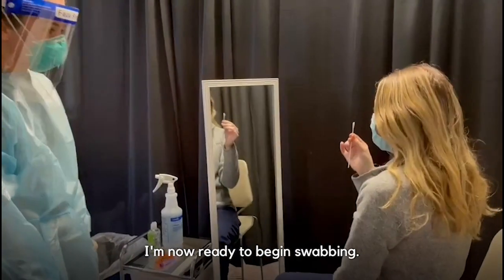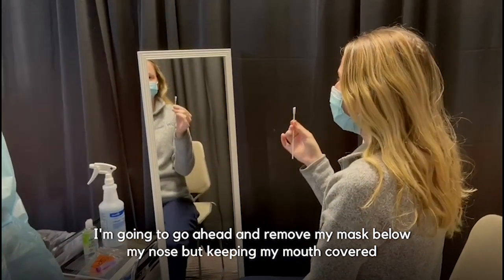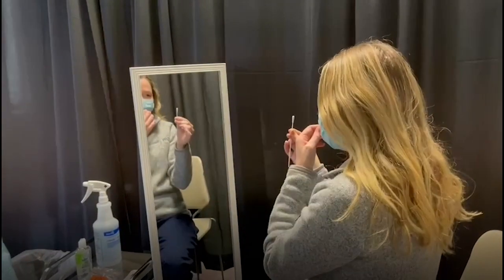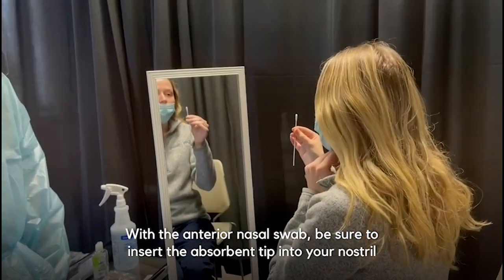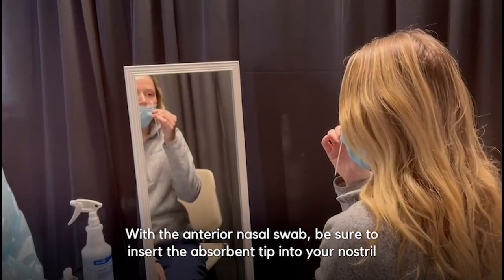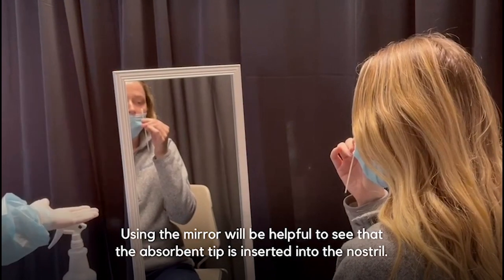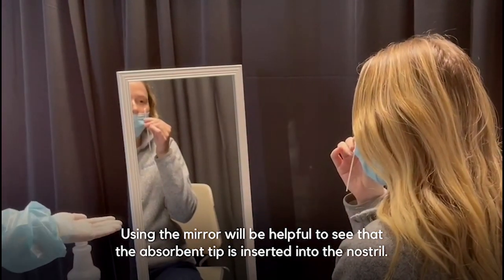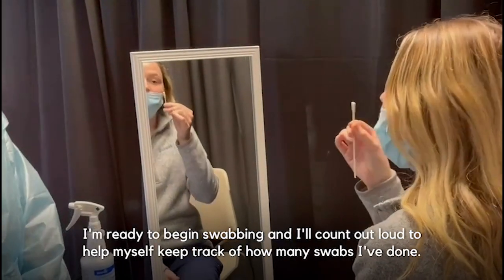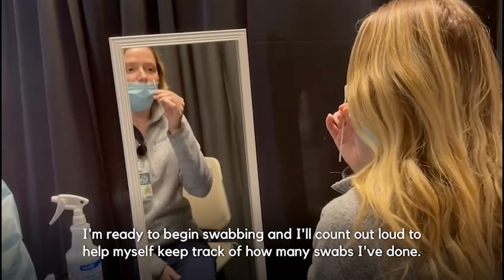I'm now ready to begin swabbing. I'm going to go ahead and remove my mask below my nose by keeping my mouth covered, and swab each nostril for 10 to 15 seconds. With the anterior nasal swab, be sure to insert the absorbent tip into your nostril no more than three-fourths of an inch. Using the mirror, it will be helpful to see that the absorbent tip is inserted into the nostril. I'll count out loud to help myself keep track of how many swabs I've done.